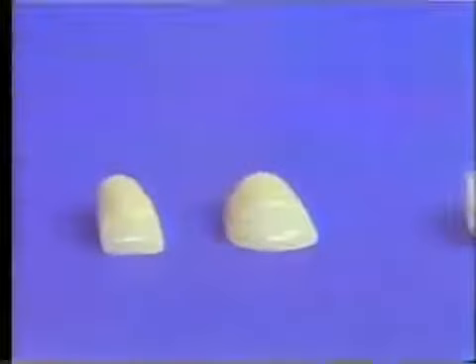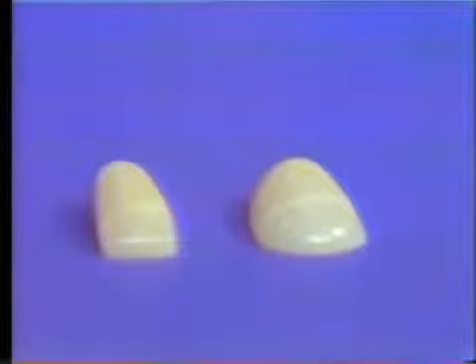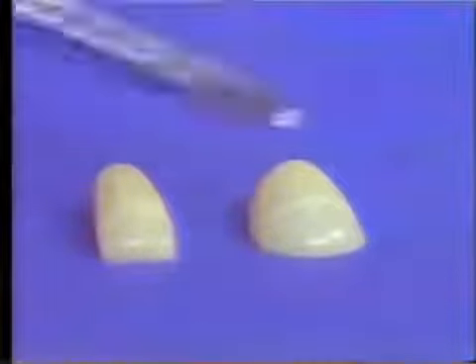This is because they come from a mold guide. And all of the facings have been marked that way, so no one will be tempted to take them out and actually use them, and then you get deficiencies in the mold guide. So that is just an artifact cut across the facing there.